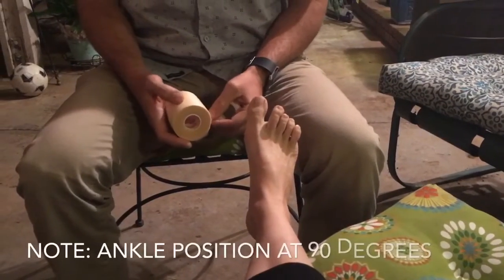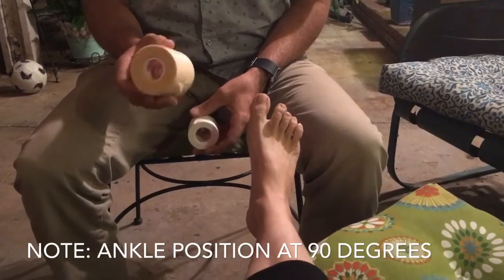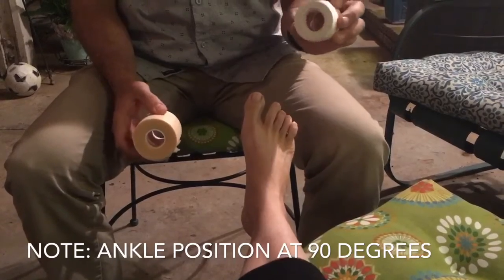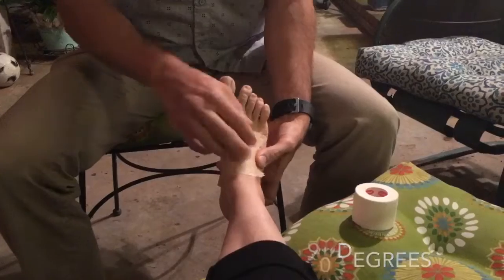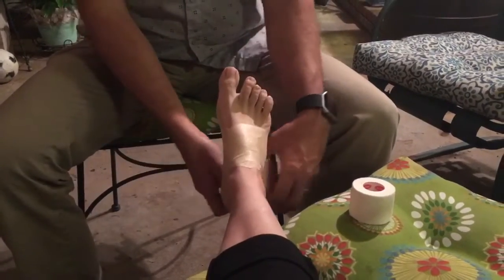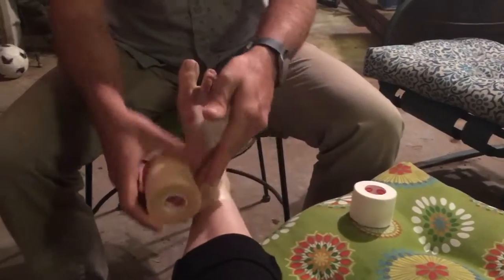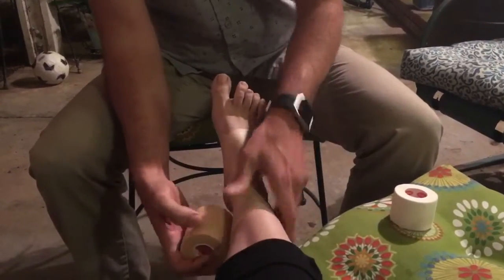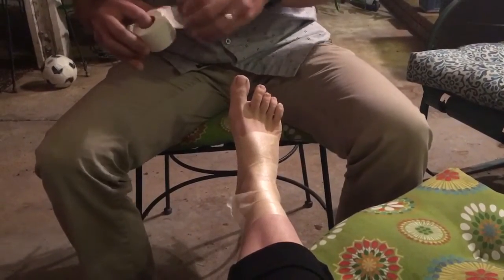All right, for our closed basket weave ankle taping, we're going to need 1 roll of pre-wrap and 1.5 inch adhesive tape. We want to first apply the pre-wrap so that we can avoid any skin irritations that could be brought on by multiple days of taping to immobilize this inversion sprain.